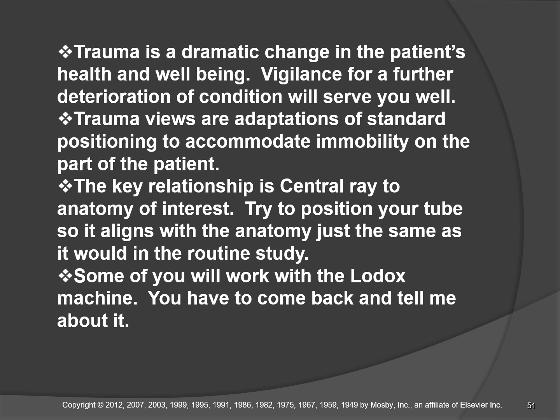Okay? Trauma views are just adaptations of conventional views. You're not able to rotate the body part or manipulate the body part, so you have to manipulate the position of the tube and the image receptor to accommodate and still get the preferred views. The key relationship that you must not sacrifice is the relationship of the central ray to the anatomy.